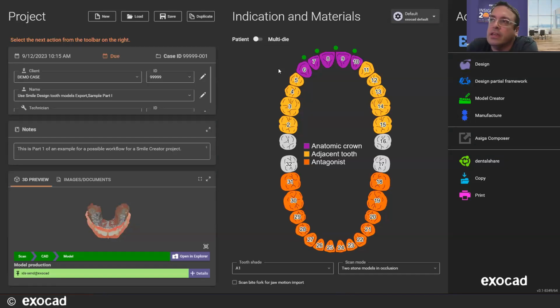One last thing came in. Can we work with impression scans? So maybe you're talking about digital impression scans, and absolutely, we have a lot of people working with intraoral scanners with our software. If you're talking about scanning physical impressions, that works also. We didn't go over that today, but there is a tool in the software to flip your meshes over. If you have a negative scan of an impression, we can work with those in the software as well.